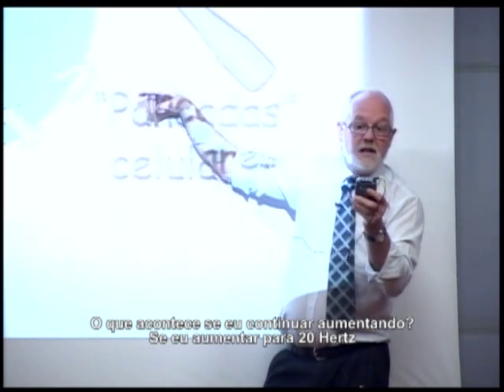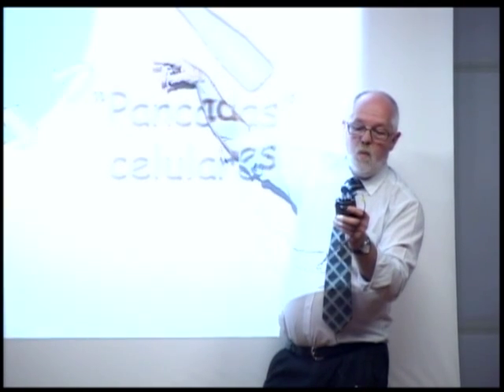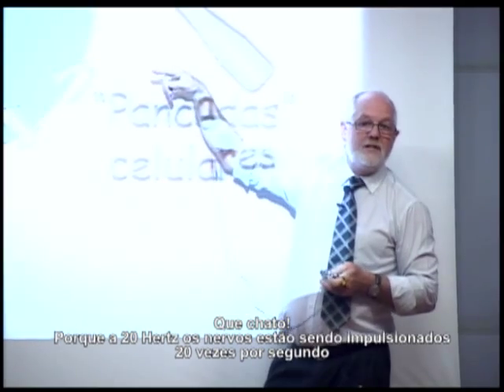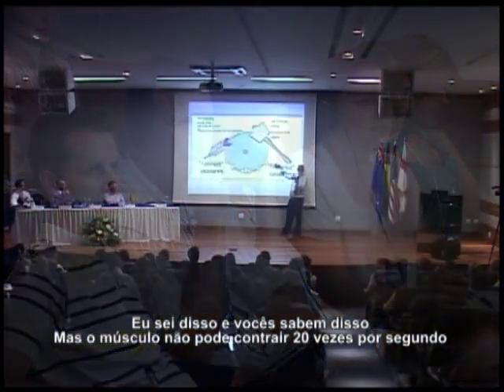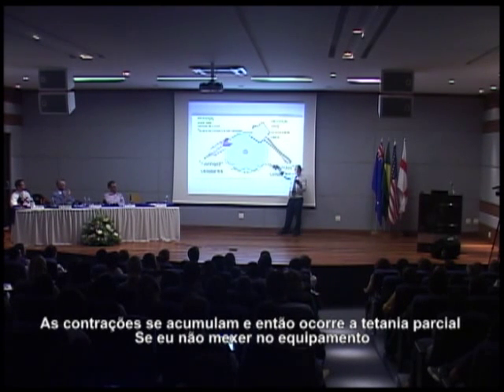All right? So if I go to 20 hertz, that's boring, because at 20 hertz, the nerve is firing 20 times a second. I know that, you know that. The muscle cannot twitch 20 times a second. So those contractions, those twitches pile up, and Scott was talking about that this morning. The twitches build up, and we have partial tetany.